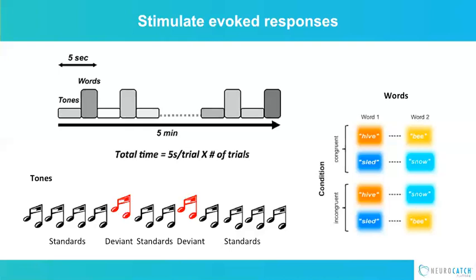So what's kind of the magic of NeuroCatch is that this was a separate experiment in research labs. And what we did is we managed to take that into one sequence that instead of running in 3 hours, runs in an automated sequence in 5 minutes.